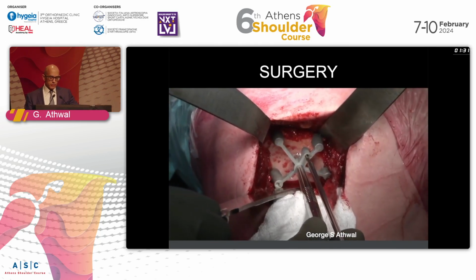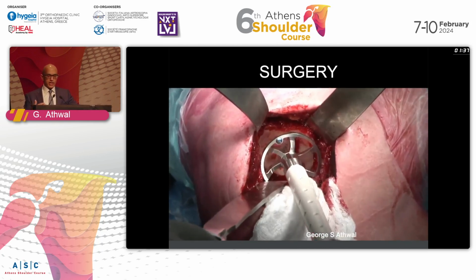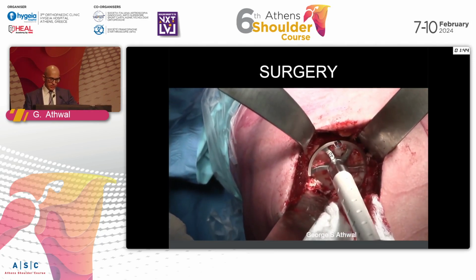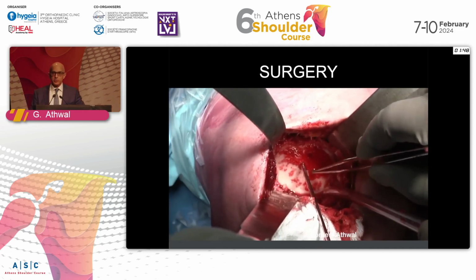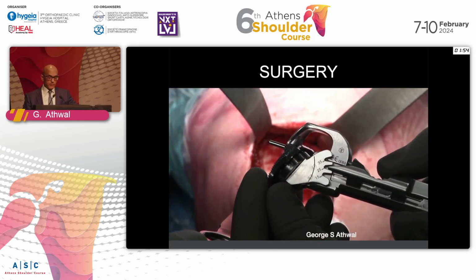And then once we adjust the rotation, we're going to start preparing the glenoid in a very traditional manner. So here we're going to prepare the anterior portion of the glenoid to get 50% coverage from the paleoglenoid. So I'll ream. And then once I've gotten that 50% coverage, now the one challenge that we have with patient-specific instrumentation right now is we don't have a depth of reaming. I think certain companies do offer that, which is actually quite a benefit.